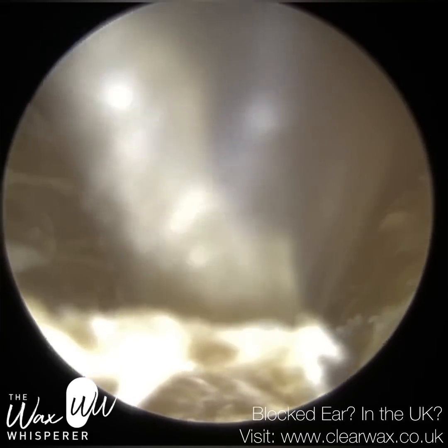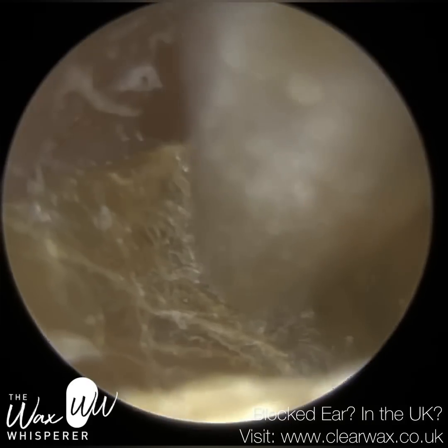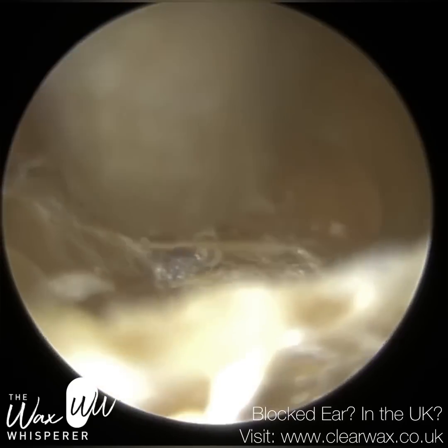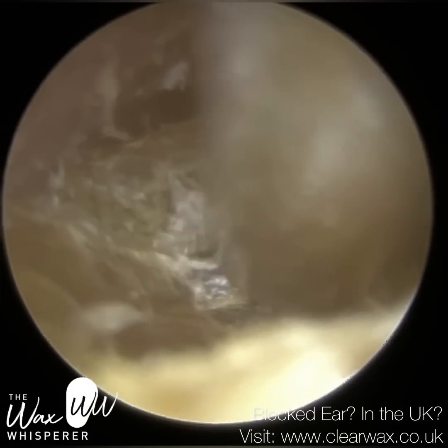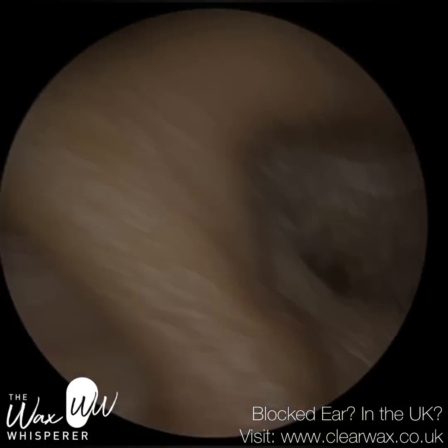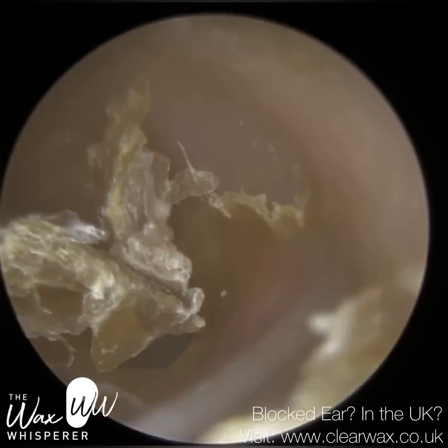And you'll see another example of me using the curette. There was no trauma caused whatsoever to the ear canal. You can see it just glided. There's no friction there. There's no blistering. And it's not to say that if I do it again, there won't be some blistering whenever you peel skin. There's always a chance. But the design of the curette is such that it's designed to minimize any trauma caused to the patient.